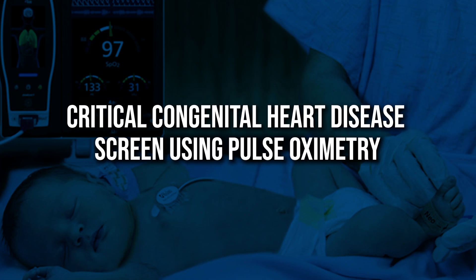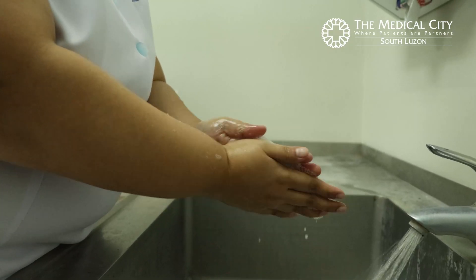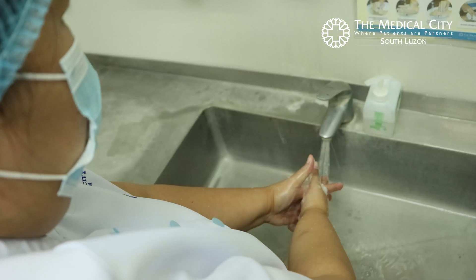This video will show you how to perform CCHD screening. Make sure to prepare all the necessary materials before the procedure. Observe proper hygiene by washing your hands.